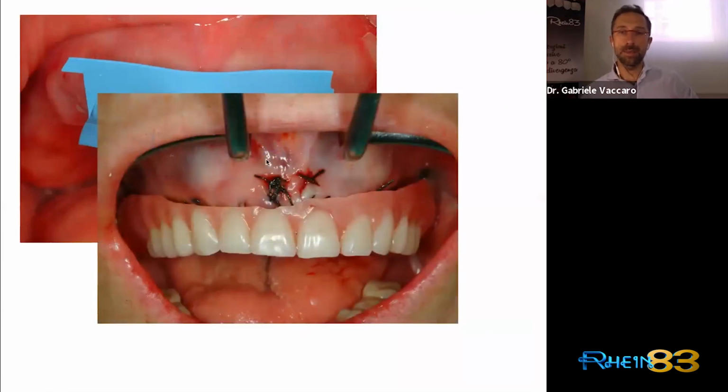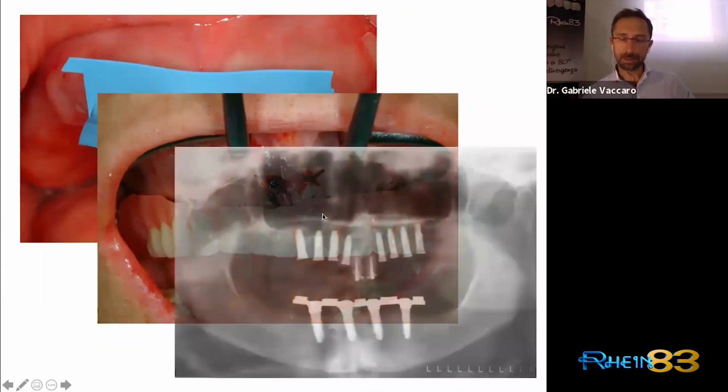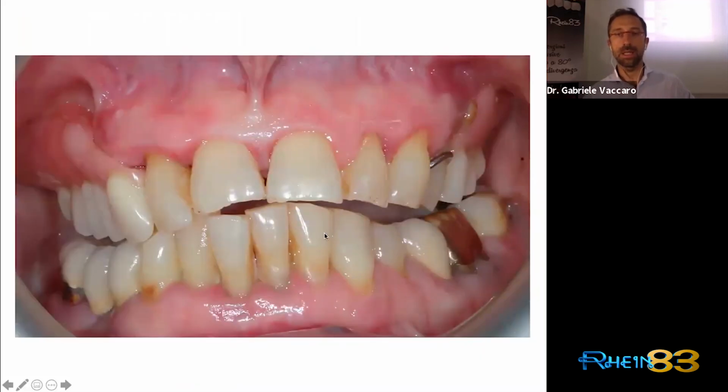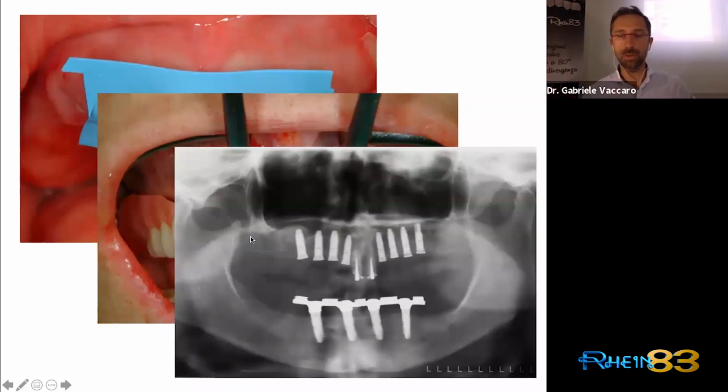And then in the lab, they have produced, they have enlarged. You remember, this patient had a partial denture, and they completed with the central incisors. And in the same seat, when we put the implant beside the central incisor, we relined the denture over that. So it was possible to wait for the integration of the implants and then make a delayed load.